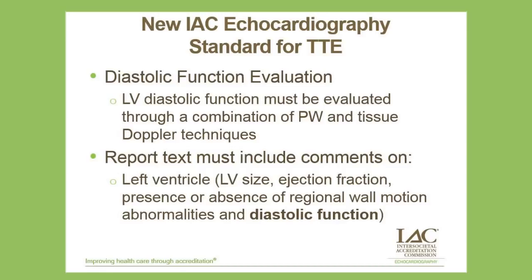And the standard states that LV diastolic function must be evaluated through a combination of pulsed wave and tissue Doppler techniques. Just how far you go is up to the lab. The requirement is that there has to be some element of pulse wave Doppler and tissue Doppler. In addition to that, you need to report on the diastolic function. The report text must include comments on the left ventricle. These other things have already been established, the LV size, EF, regionals, and diastolic function, so that's the new piece.